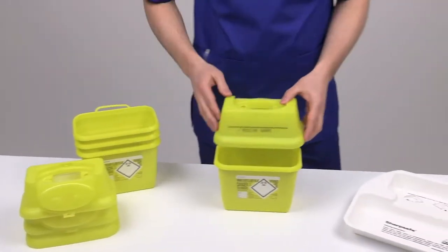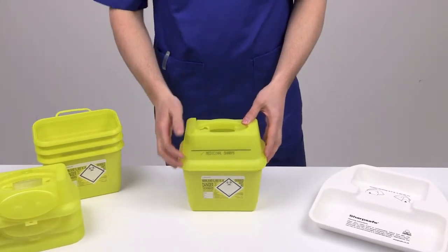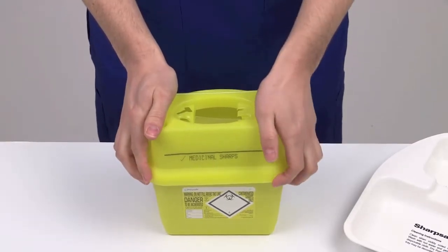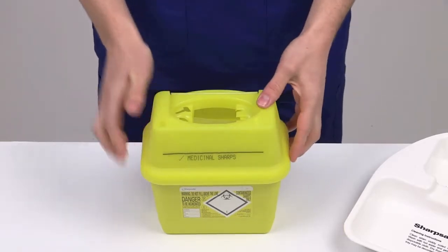Fit the lid and base together, ensuring that the line and label are on the same side. When the lid and base are aligned, apply pressure to each corner in turn until four clicks are heard. Ensure each corner is secured before use.